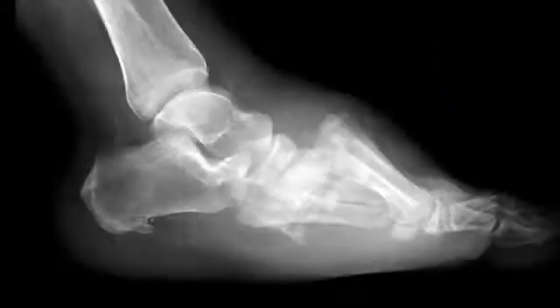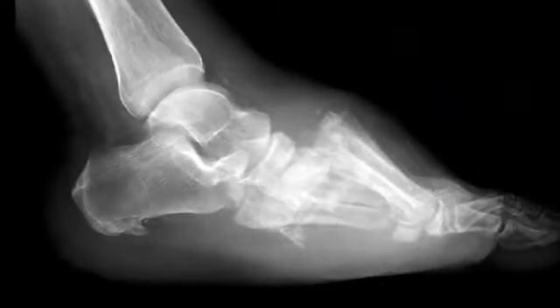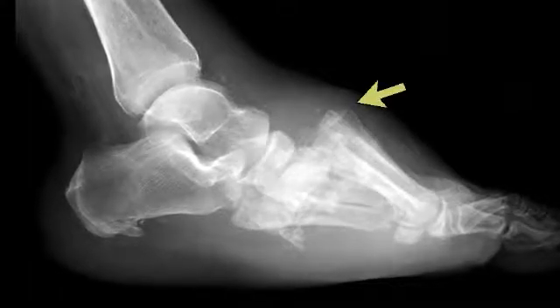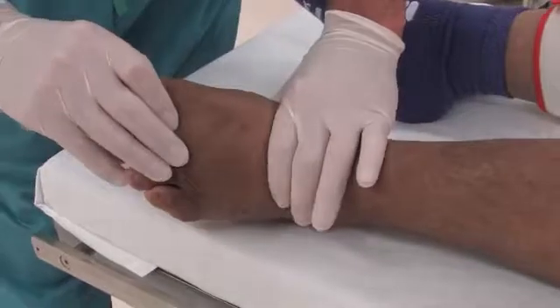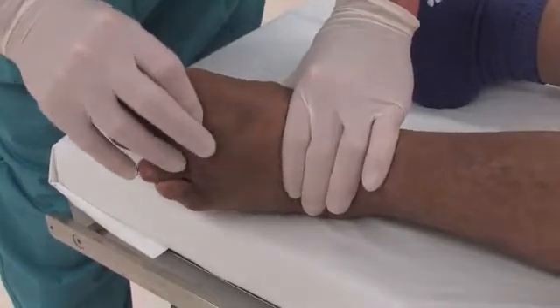On the lateral view, you can see the dorsal displacement of the metatarsals on top of the midfoot. This has caused a shortening of the midfoot and a thickening of the midfoot. At this point, he has a very unstable midfoot. He's going to have a direct plantar prominence.